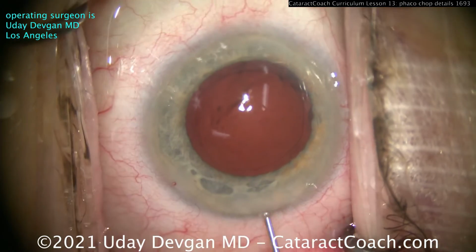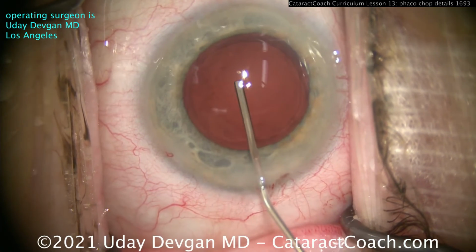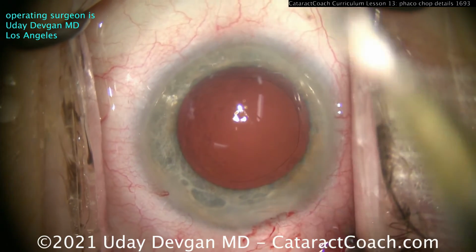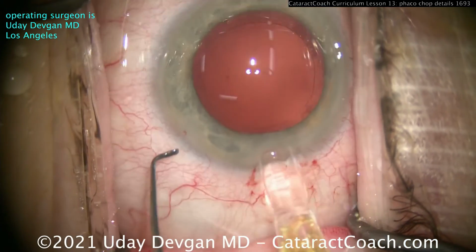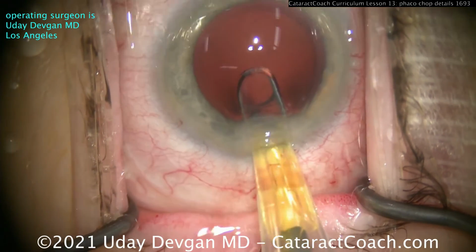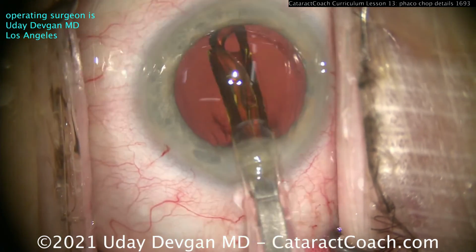Again, this is another series of my complete cataract cases. And these complete cases are the entire case start to finish. And this is a pretty good looking case. And I encourage you, if you're just starting off, if you've done fewer than 1,000 surgeries, you can achieve this. It's just hard work. If you want to achieve it, tell me, how hard do you want to work?